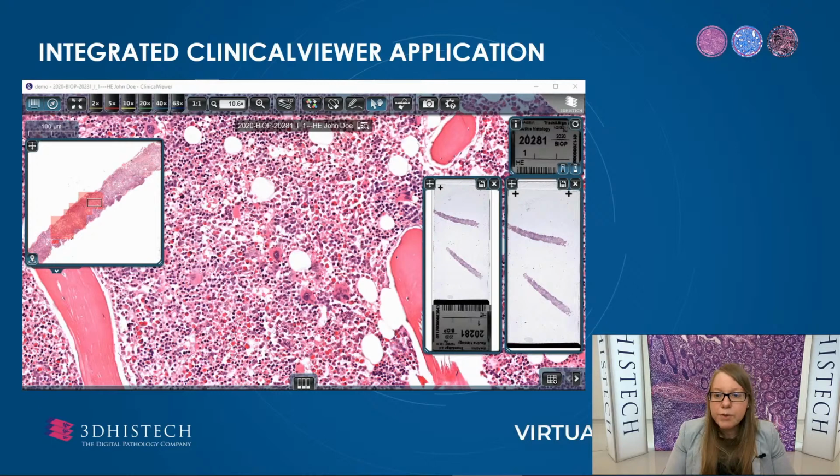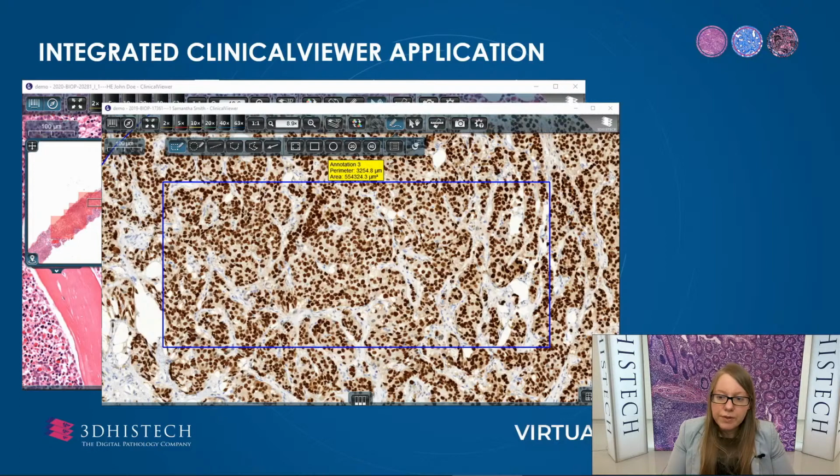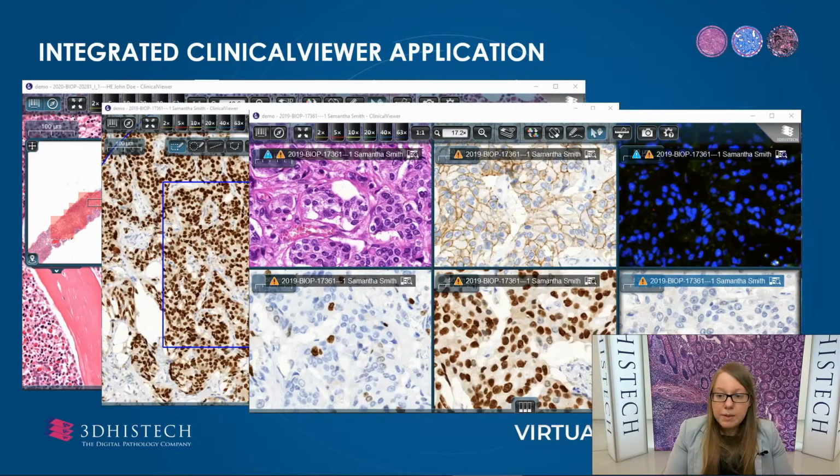The software offers the following features: zooming of the digital slides, display of preview and label area images, and it helps to navigate on digital slides with an overview of the tracking history. If we would like to display more slides of the case in the viewer, the multiple view function is suited for it.